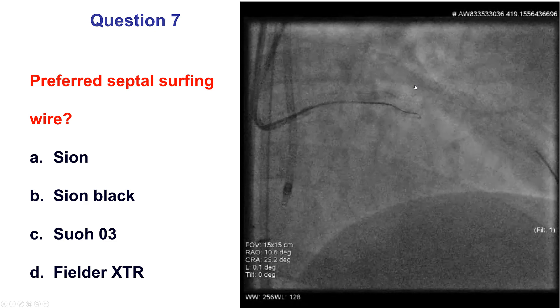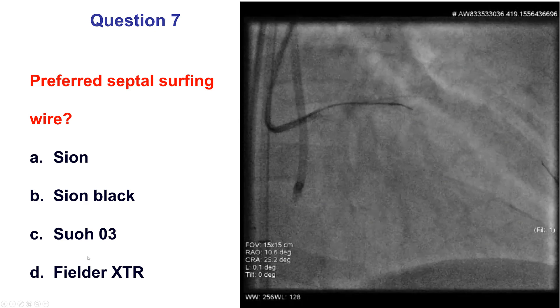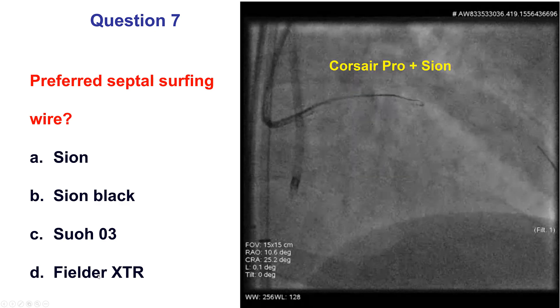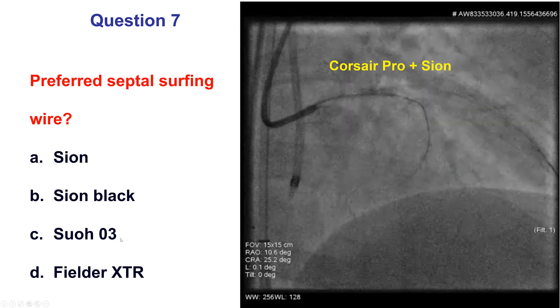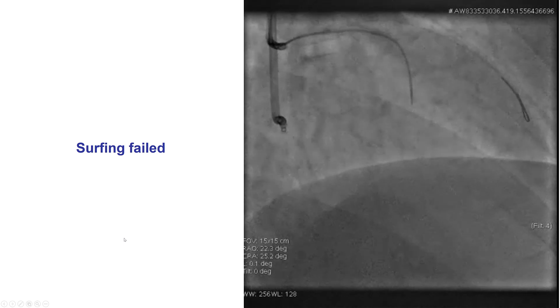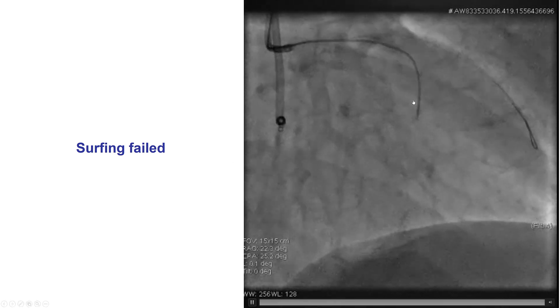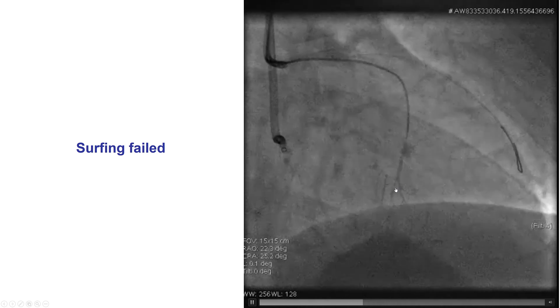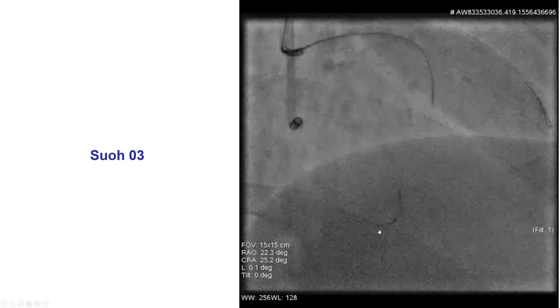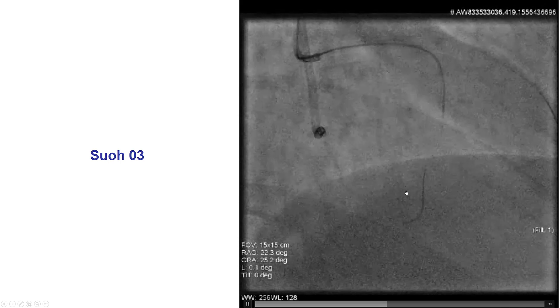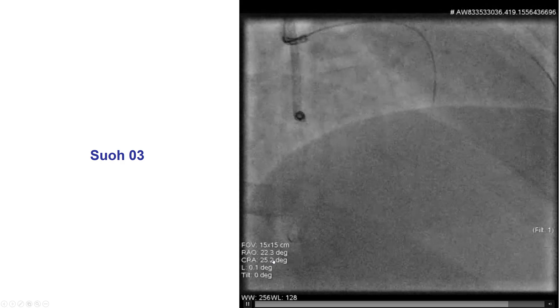After stenting the LAD, we went retrograde through the LAD and the septal collaterals. This is a fairly large septal collateral. There are different septal surfing wires, and in our practice we are increasingly using the SUO3, which is a very soft 0.3-gram wire that tracks very well through tortuosity and works well for both septal and epicardial collaterals. We did surfing — it didn't work initially. We did a contrast injection through the microcatheter, saw a network of connections, and used the SUO3 again. After multiple manipulations, the wire found its way tracking across the course of the right coronary artery.